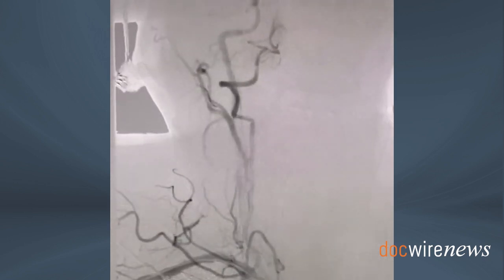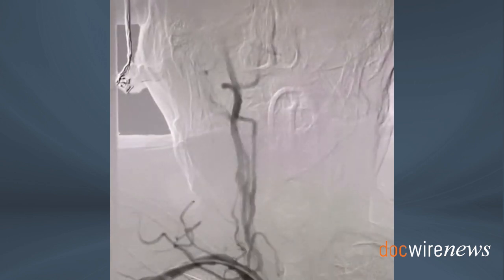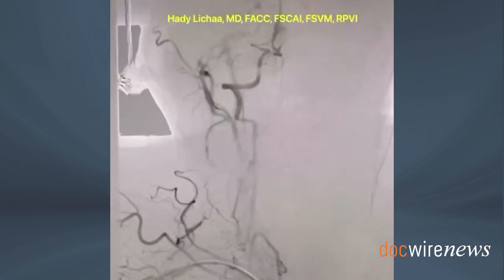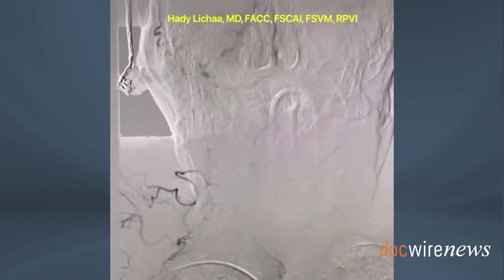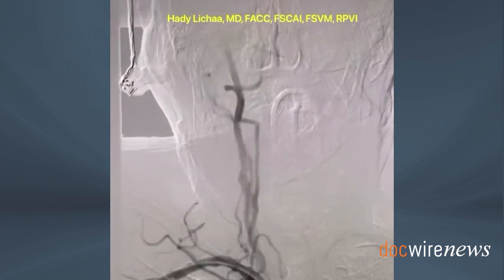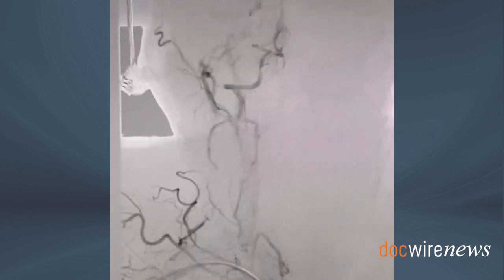Then finally, right subclavian angiography is very important to visualize the right vertebral artery flow. You'll notice here a right-to-left vertebral crossover consistent with left subclavian steal syndrome.